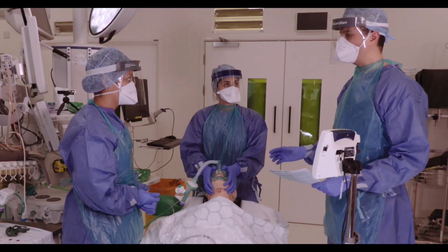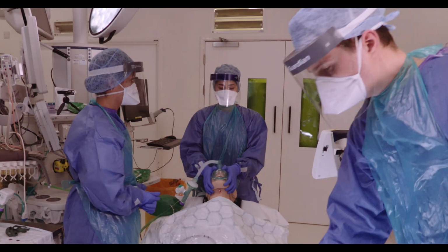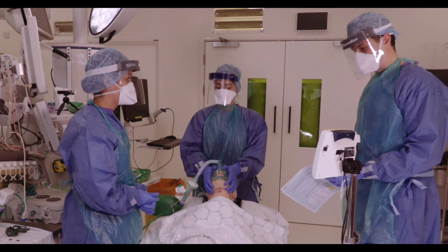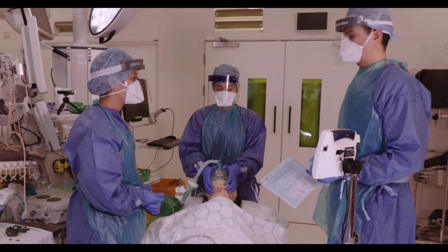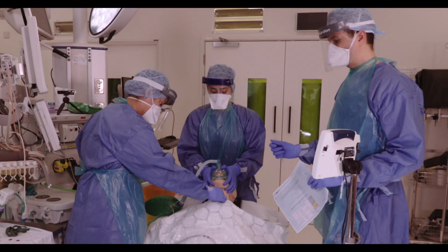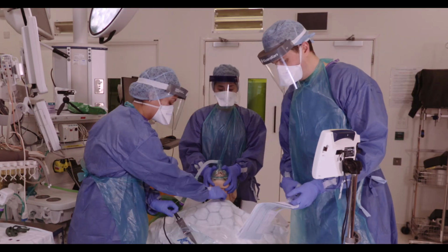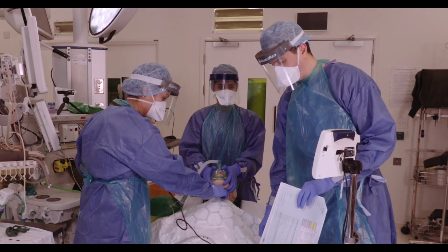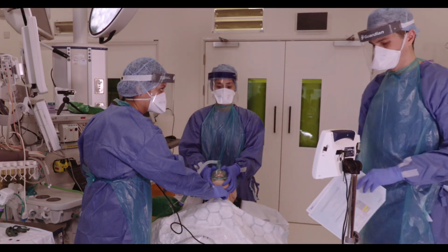Good. You let us know when the 3 minutes are over. I'm going to get the medication ready. Excellent. Are you ready? I'm ready, I'm happy. You ready? I'm ready. Brilliant. I'll give some fentanyl. I'll give some ketamine. And rocuronium is in. Time. I'm going to control. Let me know when 60 seconds are left.